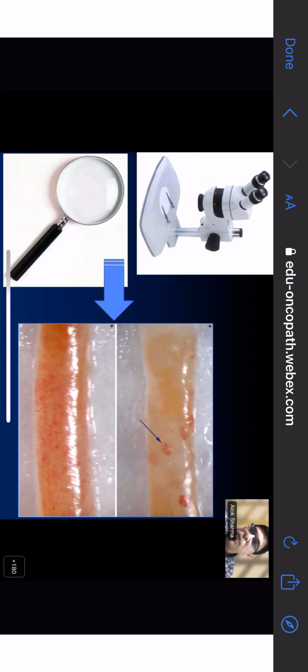So when it comes to the pathologist, there are two things which can be done. Either this can be done on site or it can be done quickly in the lab. If the lab is located within the hospital, you can take a fresh biopsy, look at it under the dissecting microscope, and try to judge the adequacy of the biopsy. If you are judging the adequacy right at the biopsy site and you feel that the biopsy is inadequate, you can request the nephrologist or the radiologist to take another core. So that's the idea of trying to judge the adequacy.